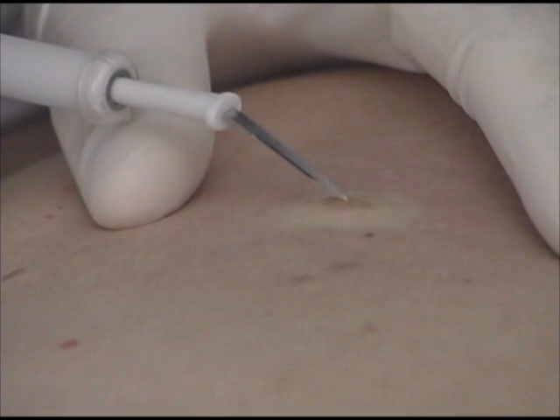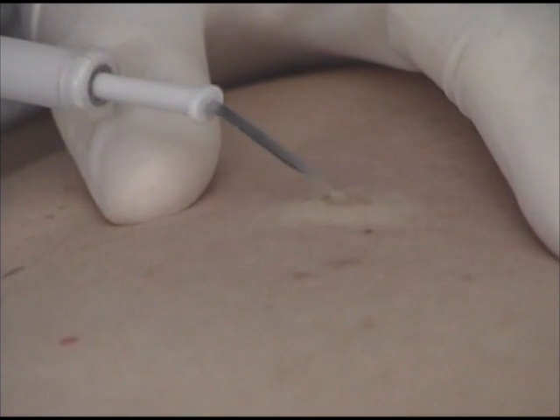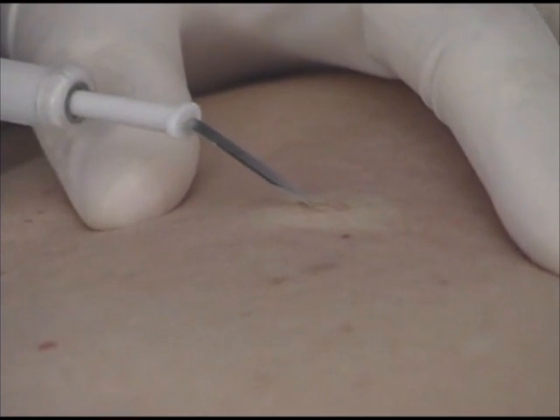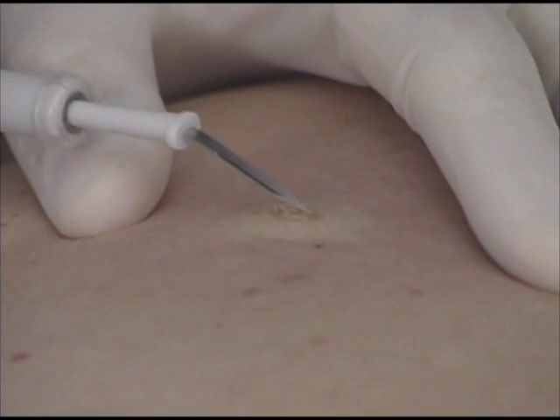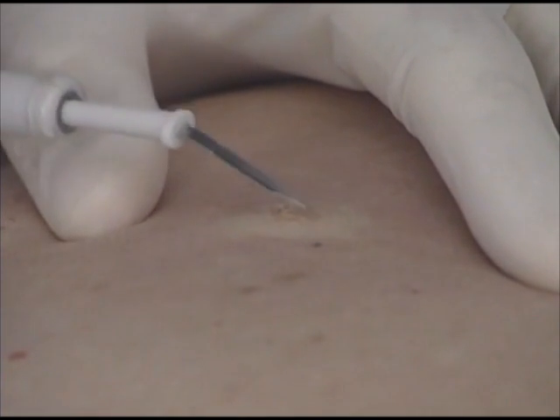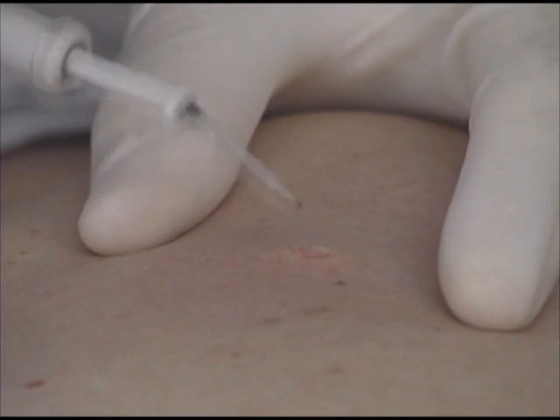This simple benign seborrheic keratosis may be destroyed without sending tissue to the pathologist. The area is first anesthetized with 1% lidocaine and epinephrine. Electrofulguration is performed lightly across the whole keratosis. Electrofulguration produces the most superficial tissue destruction and is therefore a good method for treating very superficial lesions. Now we should be able to wipe away the residual tissue with a gauze pad. This is called sponge curettage and may be done with a wet and/or dry gauze pad. Residual fragments or bleeding points can be treated by electrosurgery. I have chosen 4 watts to complete the procedure. This method produces little to no scarring because we have removed the seborrheic keratosis at the epidermal level and minimized damage to the dermis.